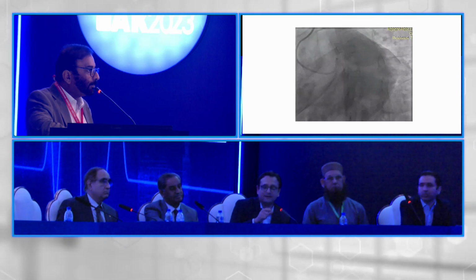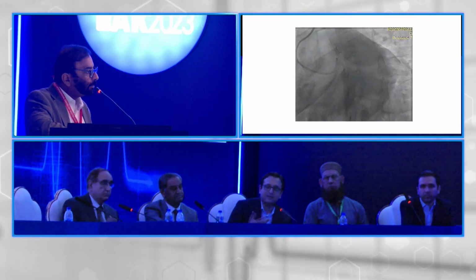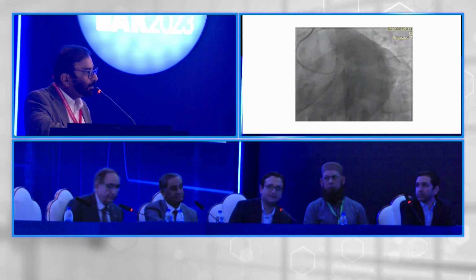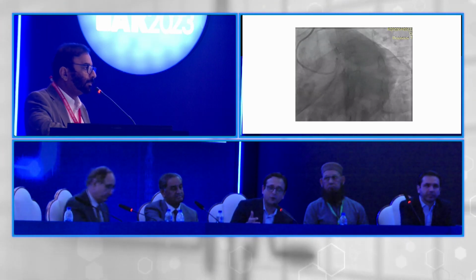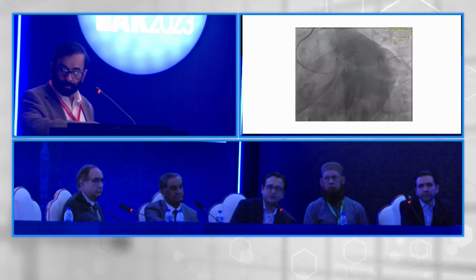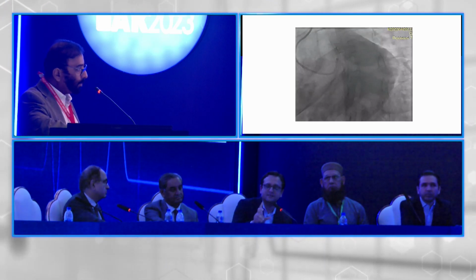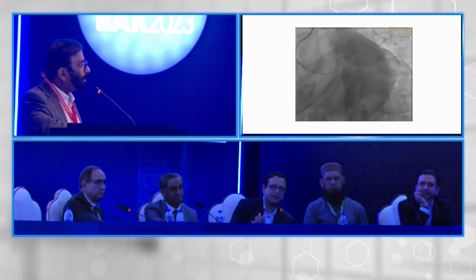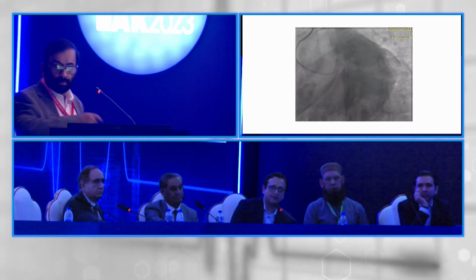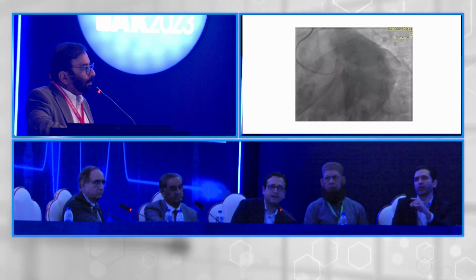I think so, again, I was definitely important. Luckily, when you have an ostial circ lesion, I am actually hoping that it's a dominant circ and not a non-dominant circ, because with a non-dominant circ you're always in the dilemma whether you come into the left main or not. For this sort of lesion, luckily the OM ostium has less than a 10 millimeter lesion, so definitely wire the OM, cutting balloon of the ostial circ, and then I'll definitely bring the stent back into the left main.